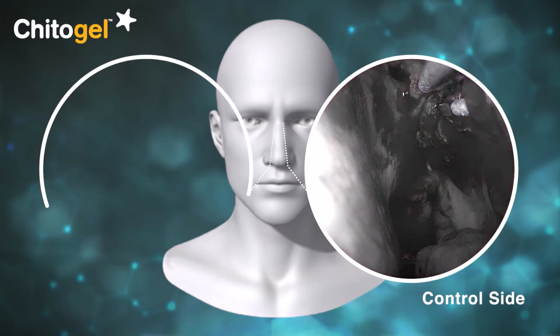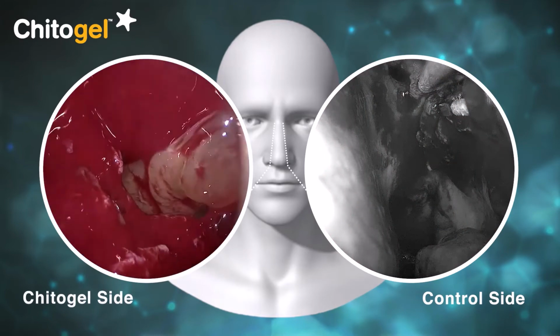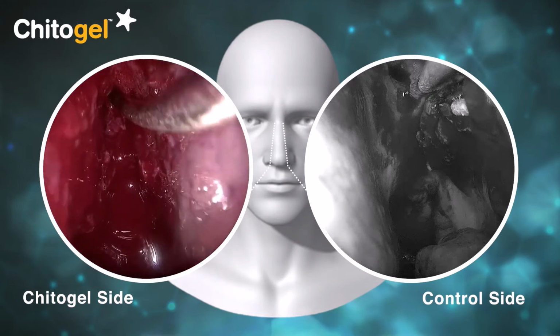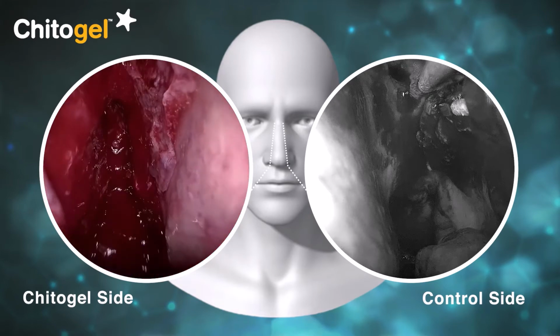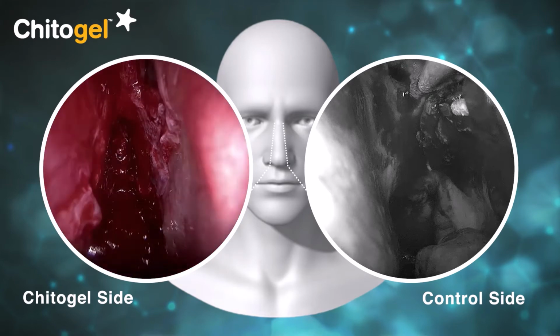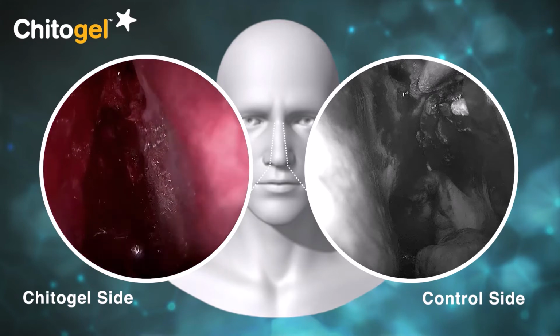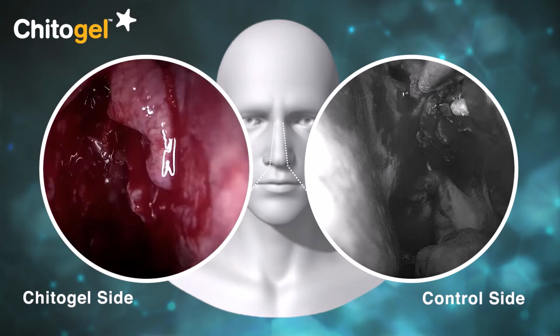When we proceed to the right side, we can see polyps medial to the middle turbinate, and when we open the maxillary sinus, there are extensive polyps present. A complete sphenoethmoidectomy has been performed, and we can visualize the frontal ostium. This is very narrow, and there's significant vascularity from the sinuses and polyps. This vascularity leads to significant ongoing bleeding, and we can see that the surgical field is generally oozy.